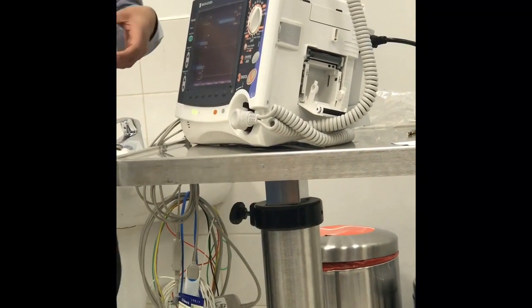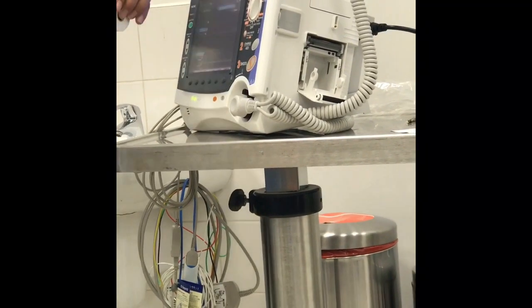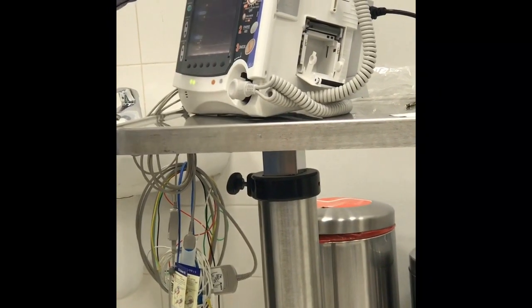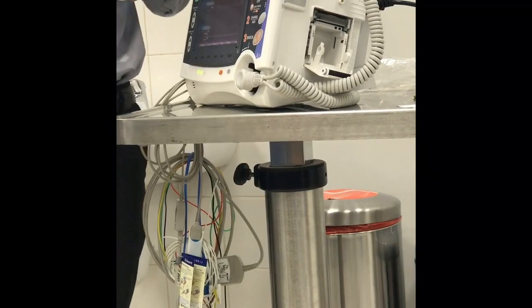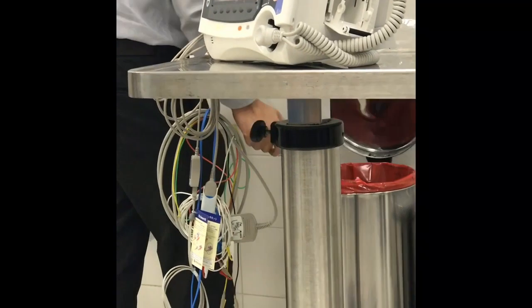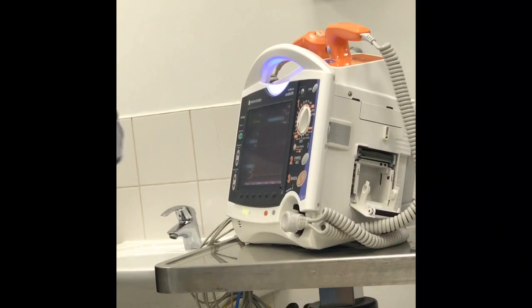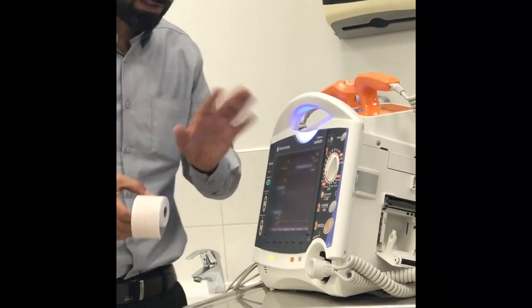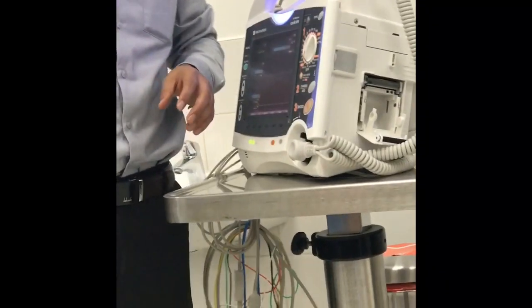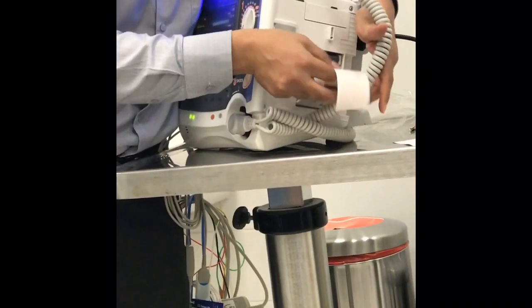What paper is it? Thermal. What is the size of that paper? 50mm. So it's the same as the other Philips, the Mindray. Mindray is the same. Other monitors, if it is the same size, you can use it. But we recommend our own for sure. As a manufacturer, we recommend using our own. So just hang it here in the roll holder. Close it. That's it. It's easy.